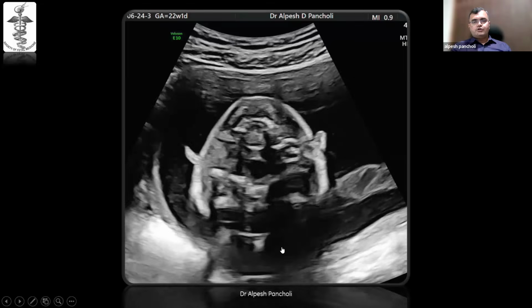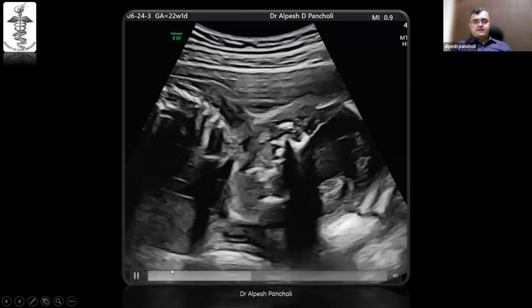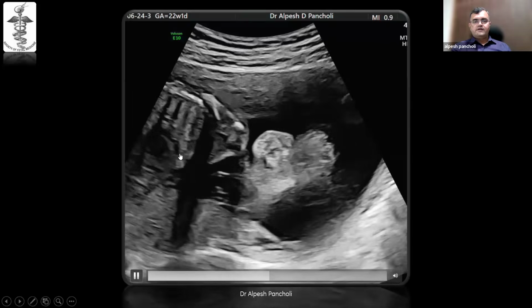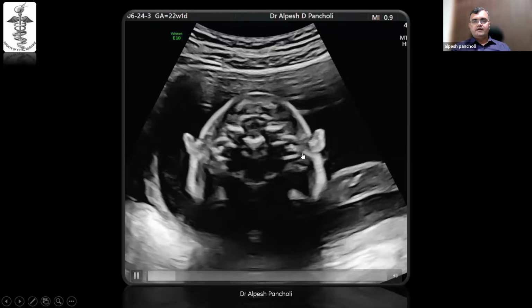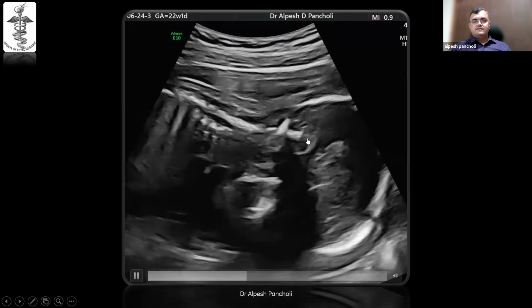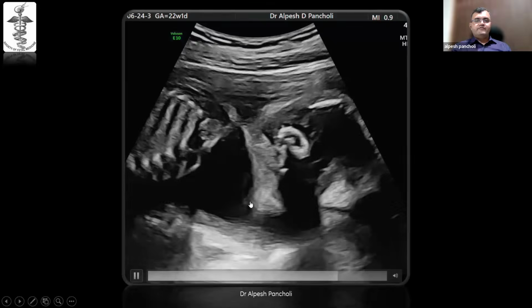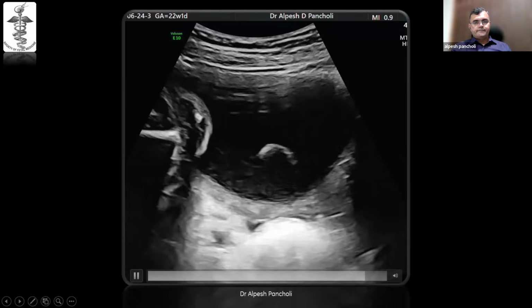So this is a very short video. In the dorso-posterior position, on the axial scan, you can see both the pinna and both the tympanic rings. Now rotate the probe 90 degrees and sweep on either side, and we can see both pinna as well. With this video, in about 15 seconds, we can complete the ear assessment.